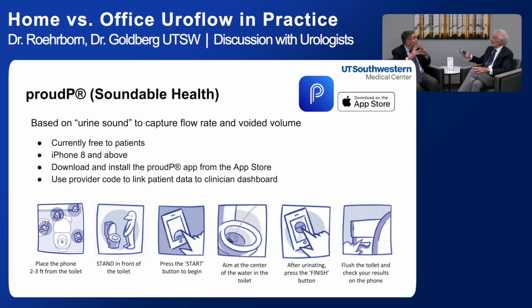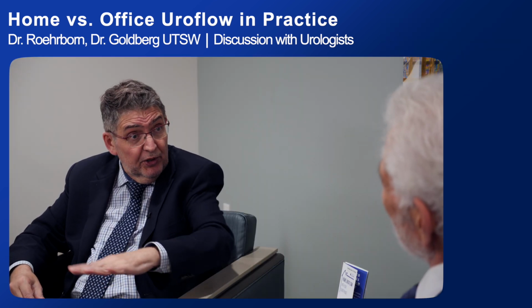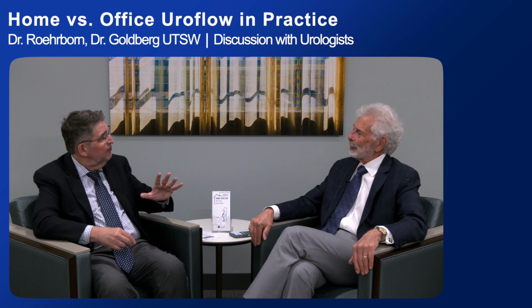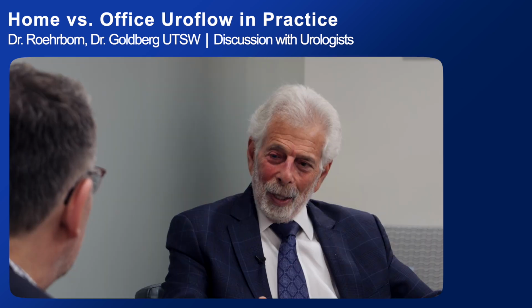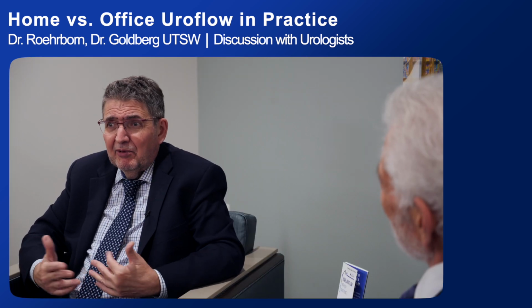So that's based on sound. Sound. And so even though this may sound gross, it's a measurement in milliseconds of the sound of urine hitting the toilet bowl. So we have to have a toilet bowl with a water level. Correct. And there can't be too much environmental noise, I don't guess, right? And the phone has to be in a certain proximity, and the microphone has to be obviously open and accessible. Correct.